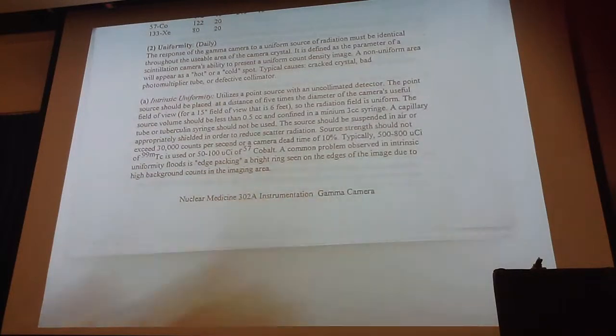And if you think I'm being hard on you, just imagine these questions being asked by the inspector from the state. They do ask you these questions. Mr. Radke, you think your central field of view is okay there? Well, I don't know. I'm only getting paid $75,000 a year to do patients. I don't have to worry about this other stuff.